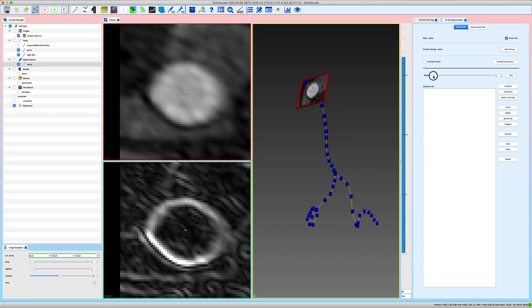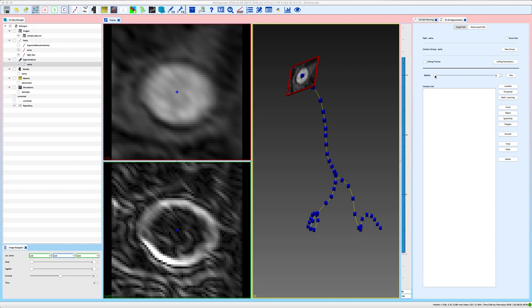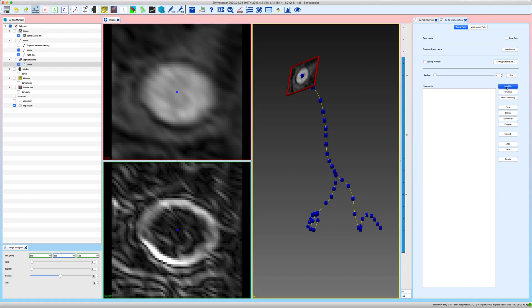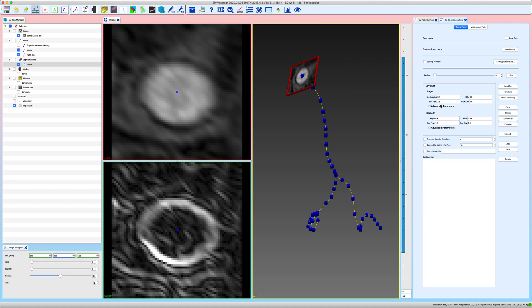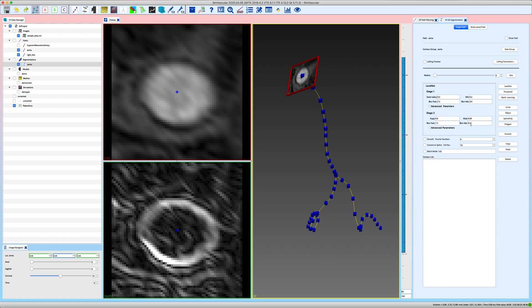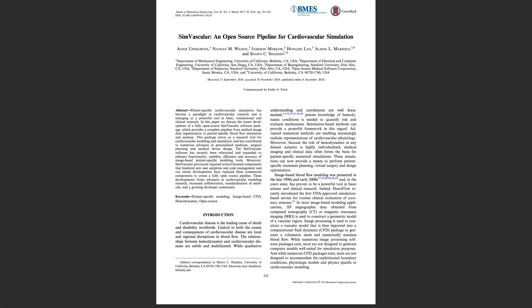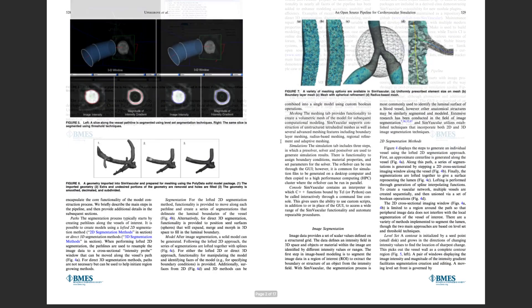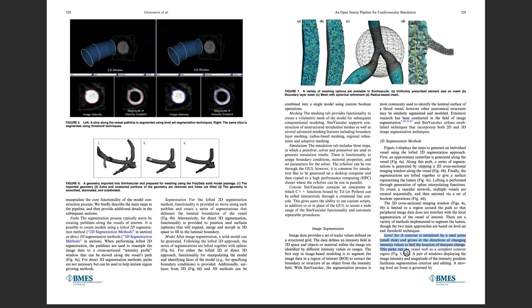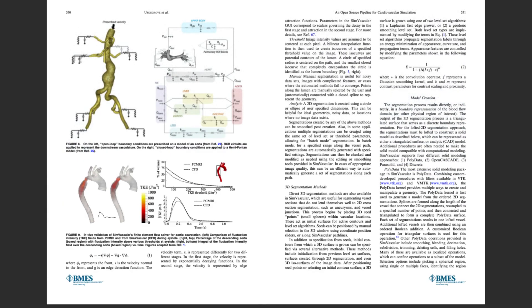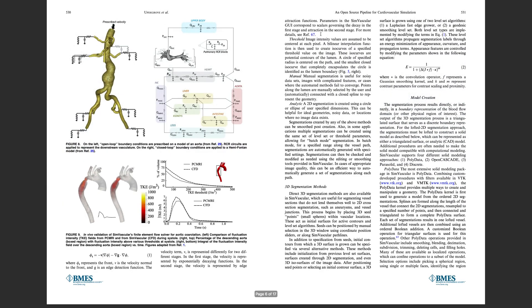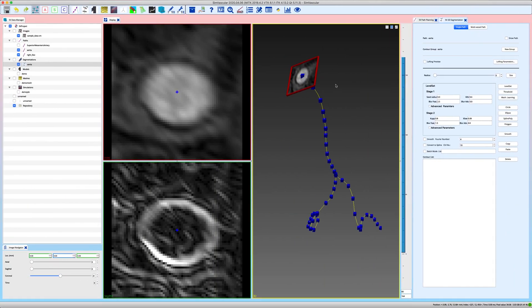Okay, so we will start by creating level set segmentations. To do that you click on level set and this window here comes up. You can see there are a couple of parameters pre-chosen and those define the two stages of the level set search algorithm. The result from this stage here we don't really see in our window but it will be the initial condition for the second stage of the level set search. If you want to know more details you can take a look at this article, SimVascular: an open source pipeline for cardiovascular simulation. On this page the level set method is described and also further references are given if you want to know more about it. Okay, otherwise these parameters usually work pretty well.